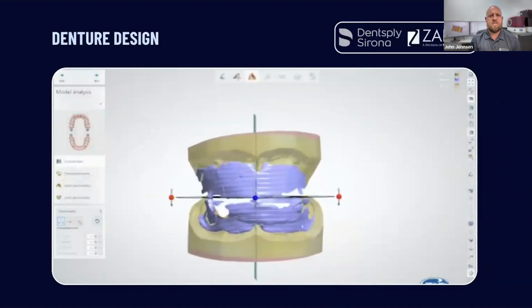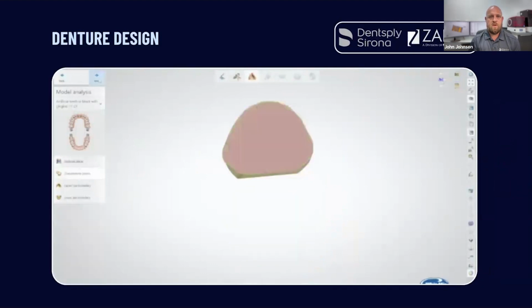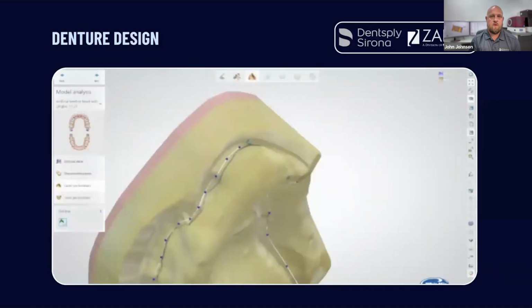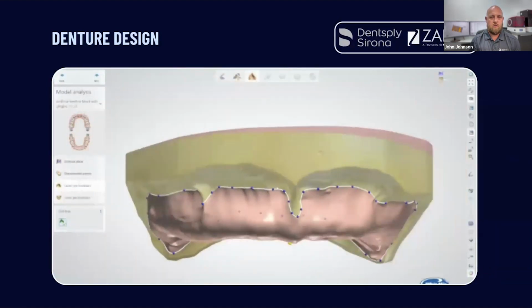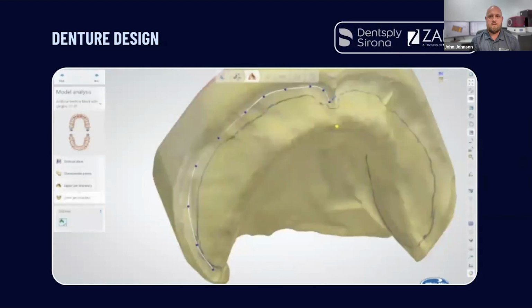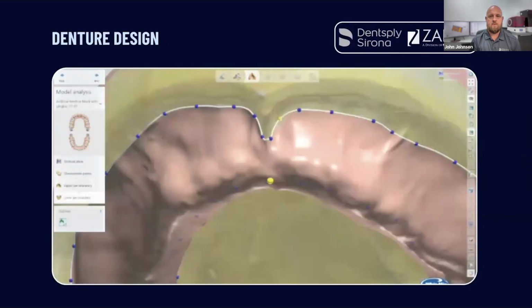This is a denture design. I sped up this little video just so we could get through it today because I want to cover a lot of things. Characteristic points, boundaries. Again, these are all items that we all know and think of as we're creating dentures physically. And I'll let it work its way through.